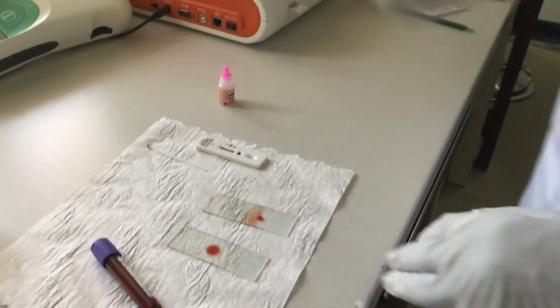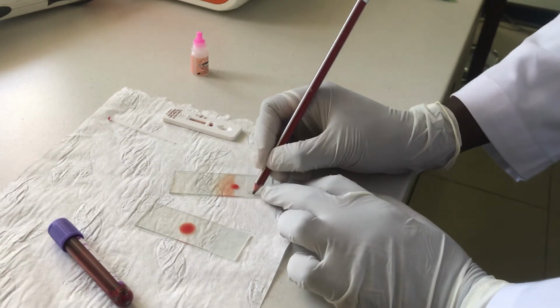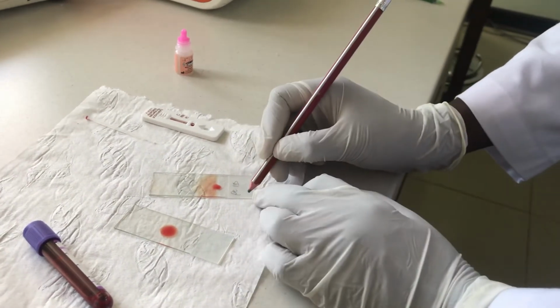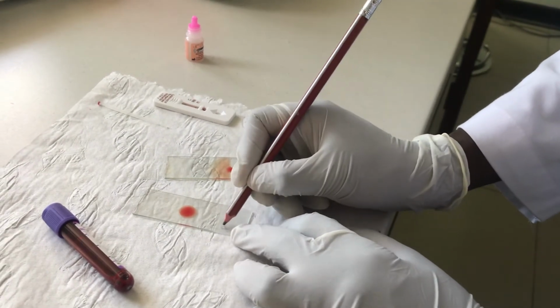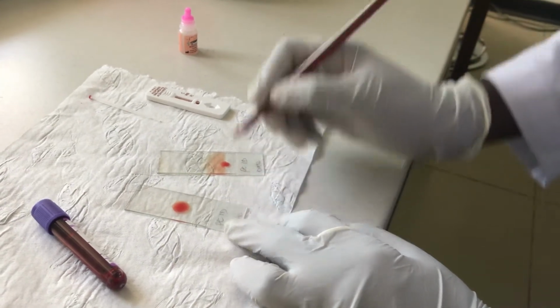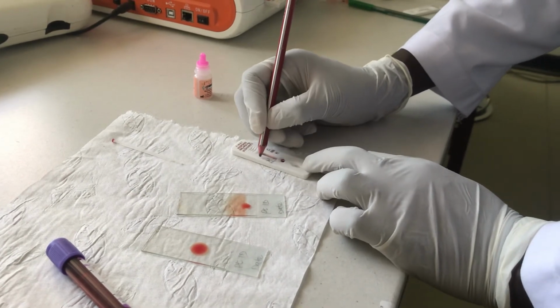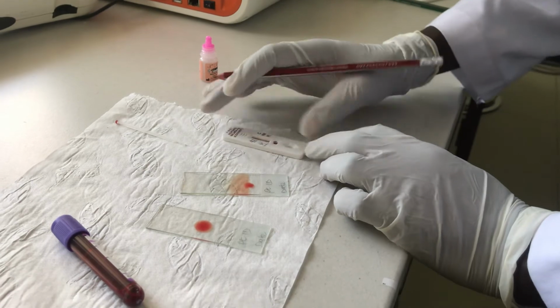These slides should be labeled by the patient's number or patient ID and the date. The same, you have the patient ID on your RDT and the date.